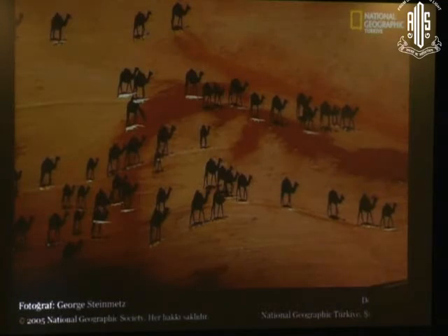I would like to emphasize that corneal perforations are sometimes elusive, and this is like this picture. We are seeing these camels basically, but these are not camels. These are just the shadows. And the camels are basically, this is the aerial photograph, and this is the camel here, this shadow, and these black camels we are seeing, they are all shadows basically. So sometimes it can be deceptive, and we have to do the Seidel test to diagnose corneal perforation.